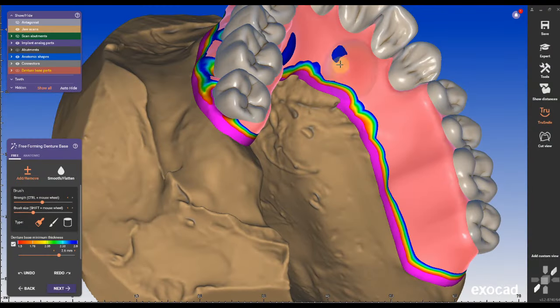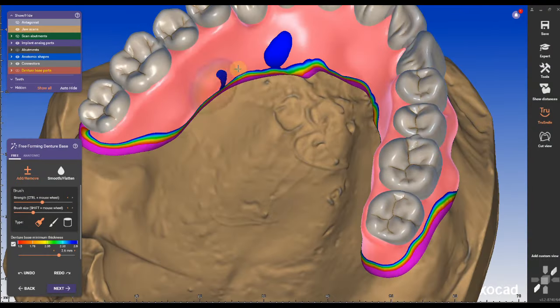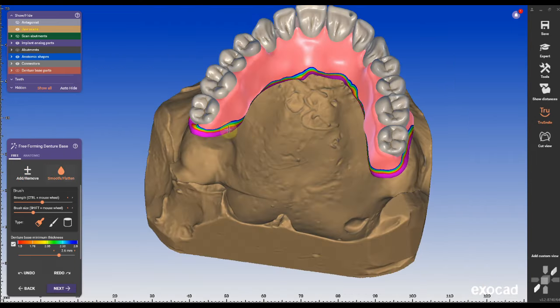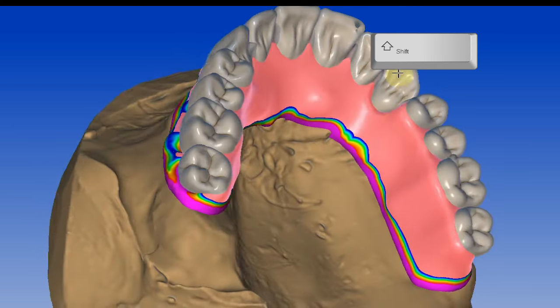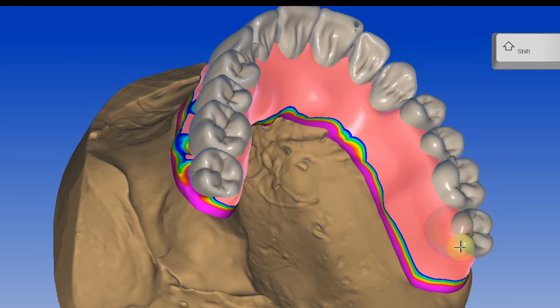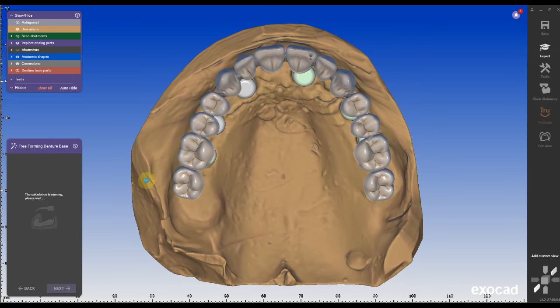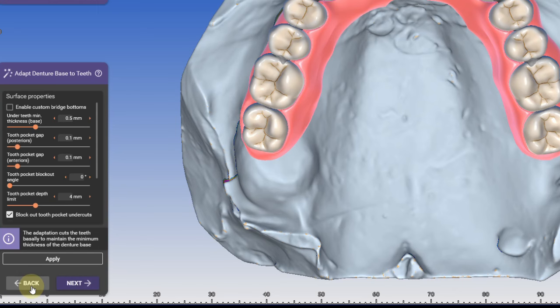I fill up some thin spots with the adding tool and smooth out the areas around the teeth while holding the shift key on the keyboard. Locator fixed restoration requires the same attention to detail at the basal surface as all-on-X cases made of zirconia for example.